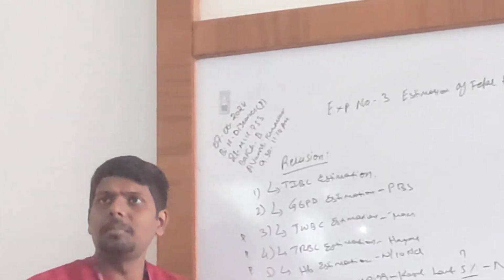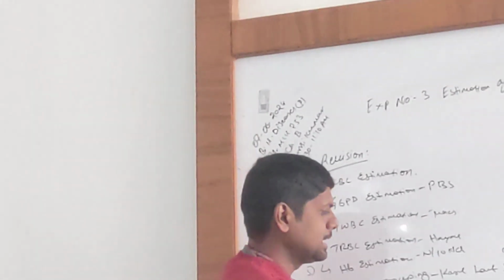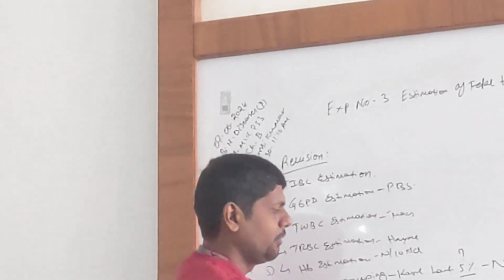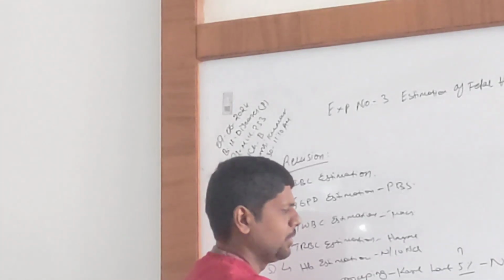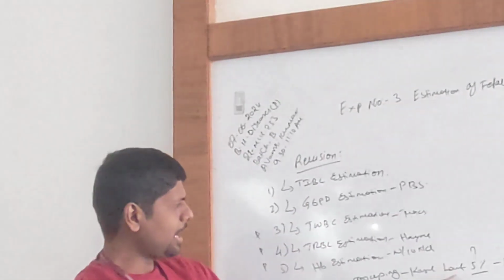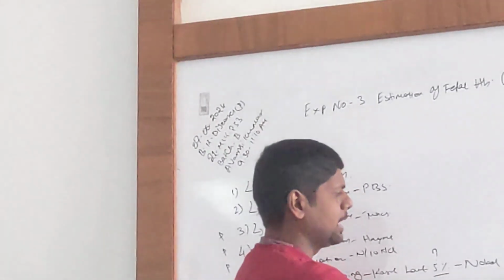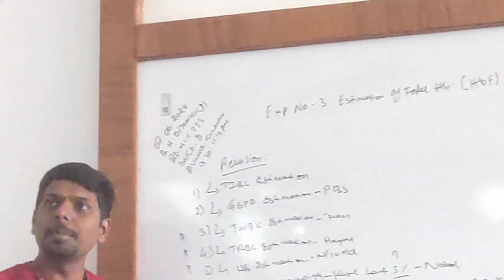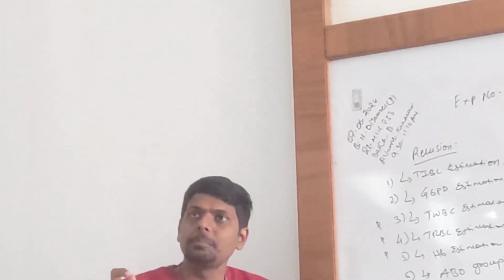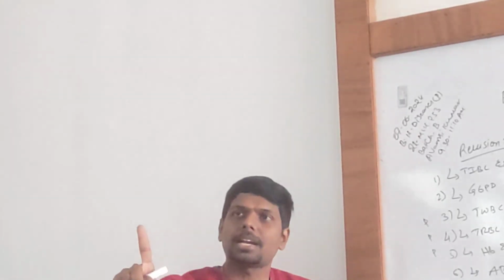Okay, if the blood has this antigen, the rhesus antigen, that is called RH positive. If blood doesn't have the RH factor, then that is RH negative. Combining RH and ABO grouping, the rate of death has been reduced to 0.5%. But still 0.5% of people might die. Out of 100 transfusions, one transfusion will get reactions.